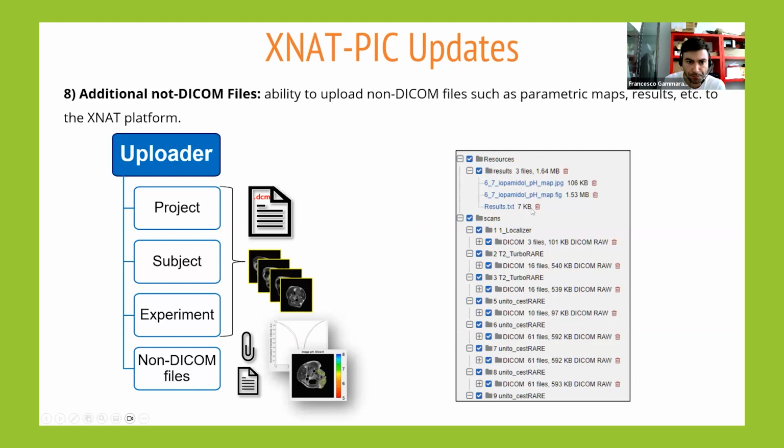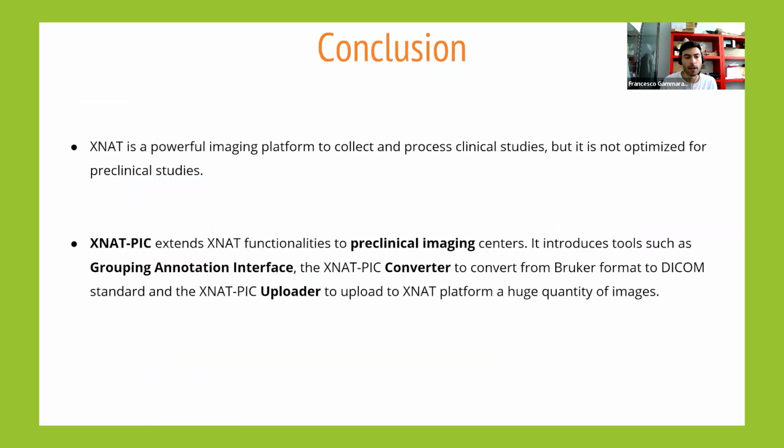TXT file. So to sum up, XNAT is a powerful imaging platform, but it is not optimized for preclinical studies. So we have developed XNAT-PIC, that stands for XNAT for Preclinical Imaging Centers, and it has some features such as grouping annotation interface, the converter, and the uploader.